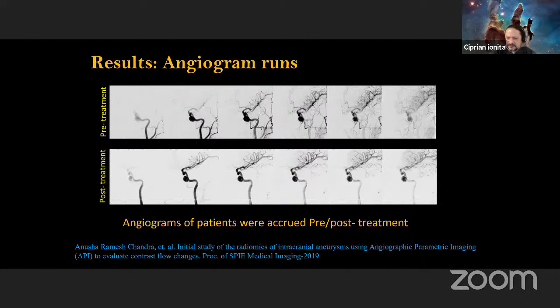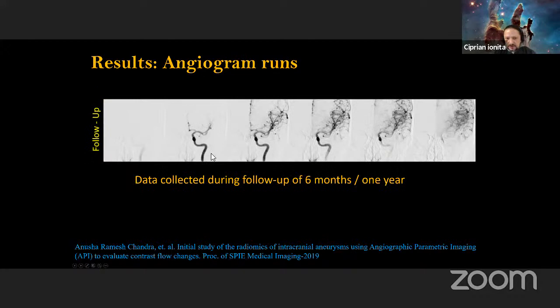You know what? I think this device doesn't have quite good wall apposition, and they go with a balloon and inflate it slightly to make sure that the pipeline device has fully apposed to the aneurysm neck. And based on these images, they have to decide. And as you can see in here, at 6 months follow-up, this is gone.